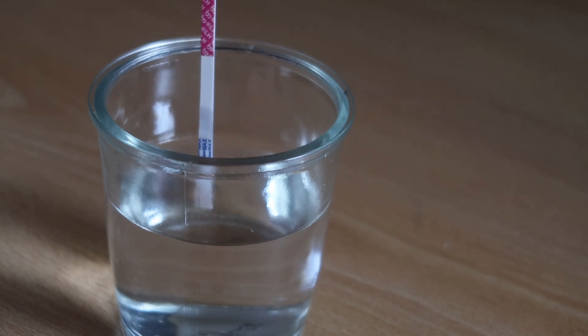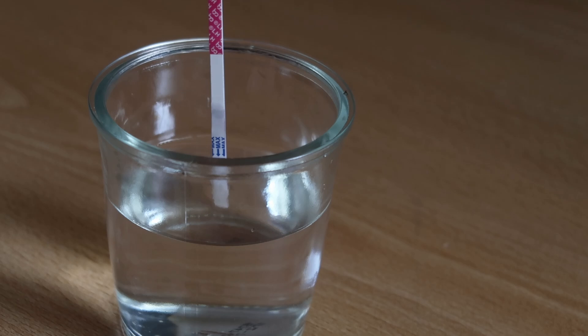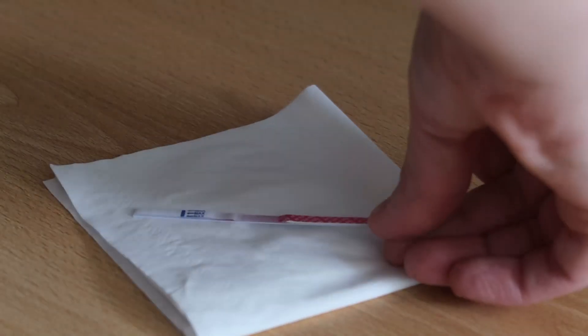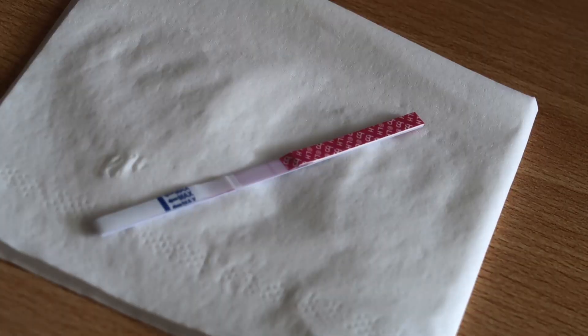Then you stick the test in right side down until the line that it indicates — the max line. You can get some of the excess fluid off and put it on a piece of paper, then you wait and you see the lines show up.